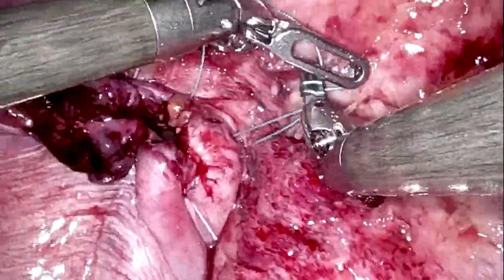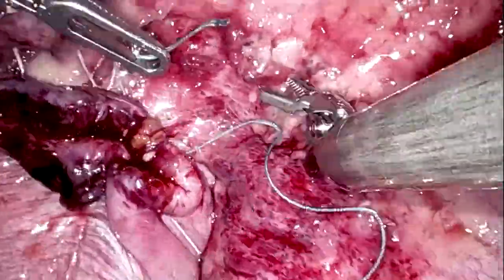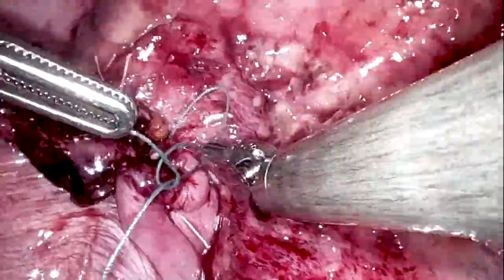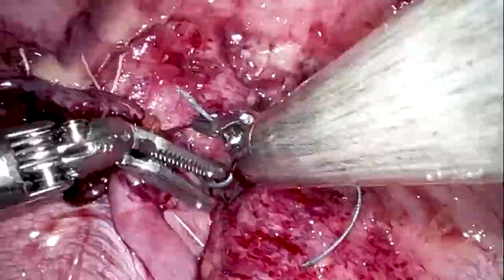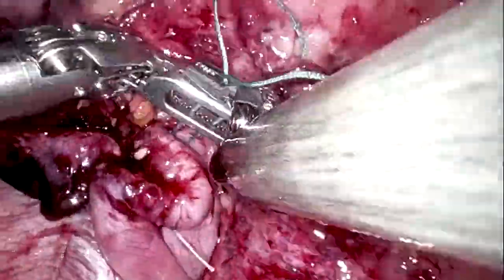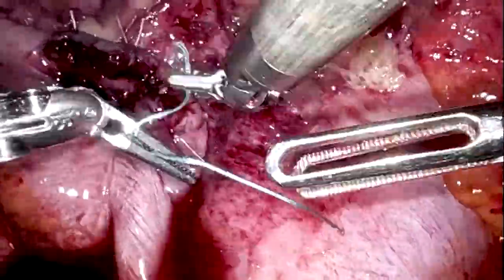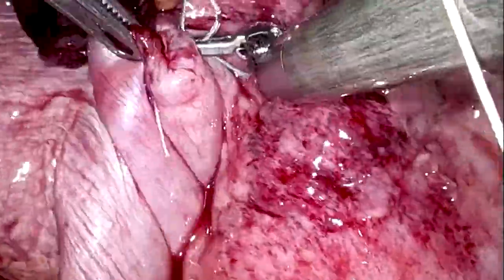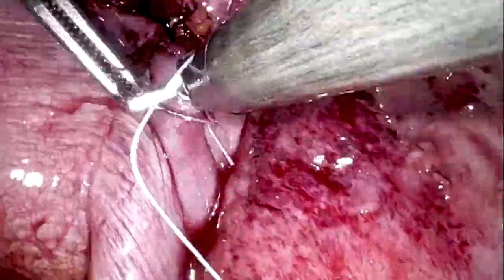Patients report that these operations are quite sore and difficult to recover from due to post-operative pain. To help manage this, surgeons typically perform a long line of intercostal nerve blocks using bupivacaine 0.25% with adrenaline, running from ribs 1 to 12. A phrenic nerve block is also placed, given that the diaphragm moves with every breath.